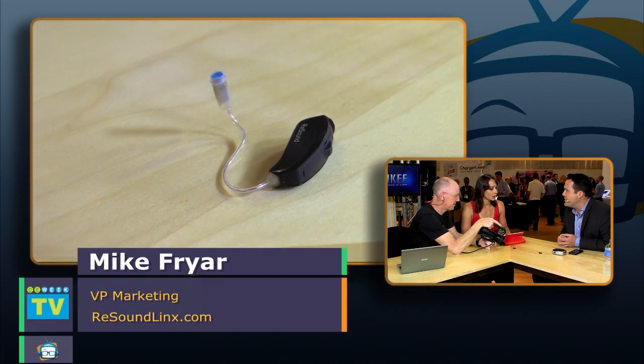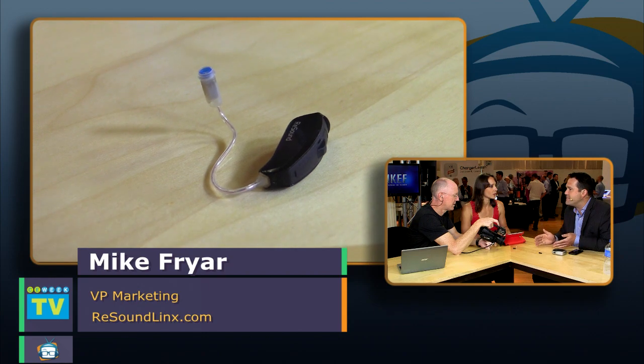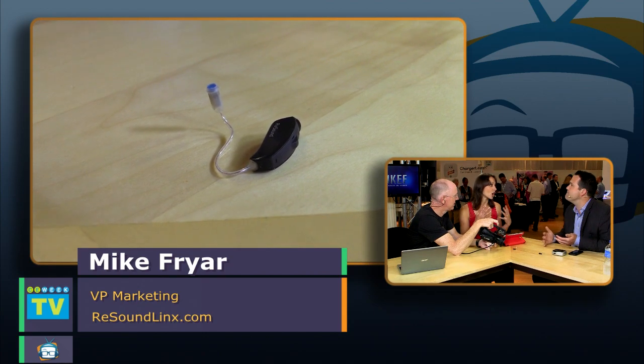So let's say you needed 2 hearing aids, which you may or may not. Just like you have 2 ears and your brain sort of synthesizes and makes them work together, these actually talk to each other and help give you the best signal to noise ratio. If one ear is stronger, it's going to accommodate for that. If there's noise in one spot and not another, if speech is over here and noise is over there, it can help you really hone in on the speech. That's amazing.